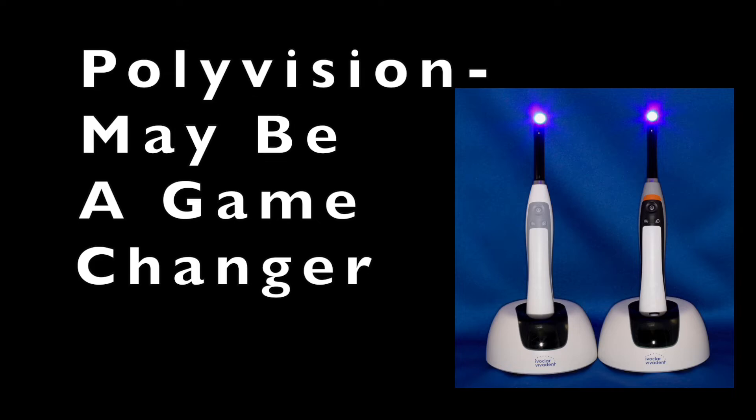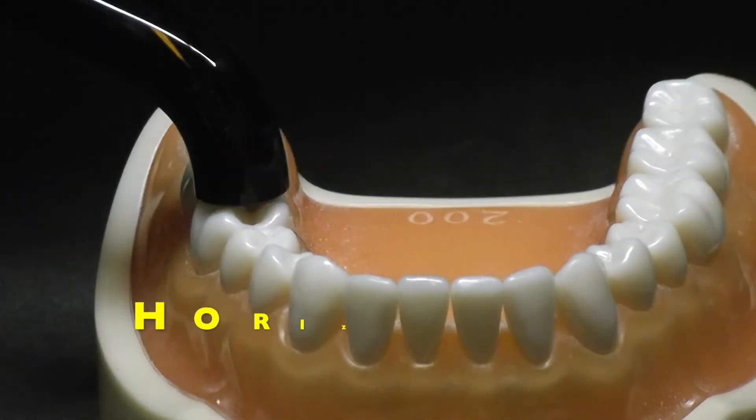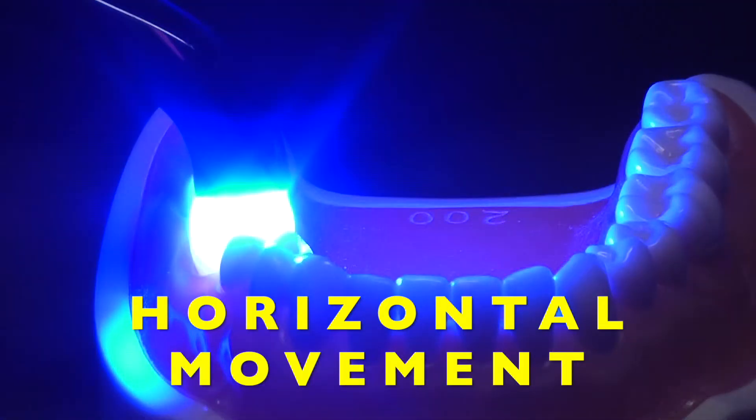Both of these lights also contain PolyVision, which may indeed be a game changer in dental curing lights. The PolyVision feature alerts the user if they move the curing light tip away from the tooth.